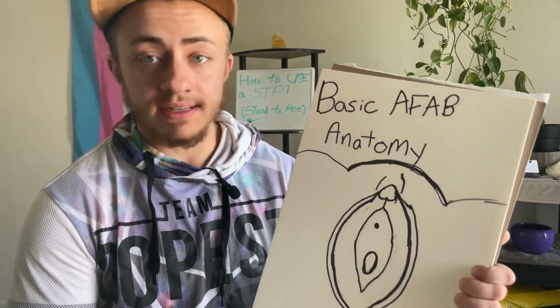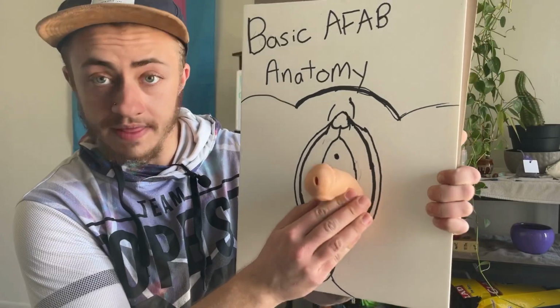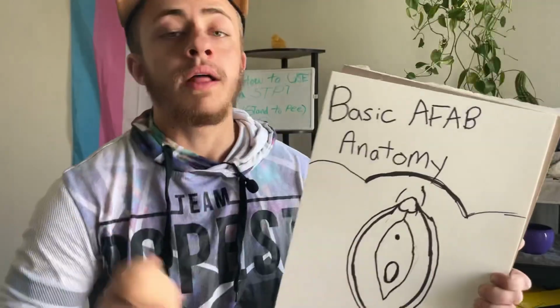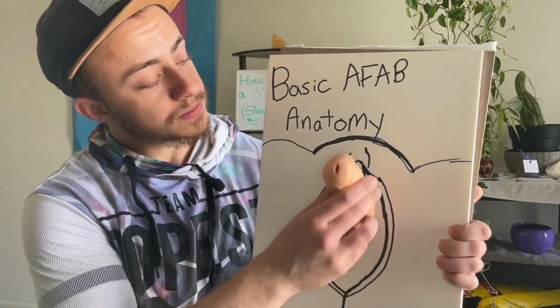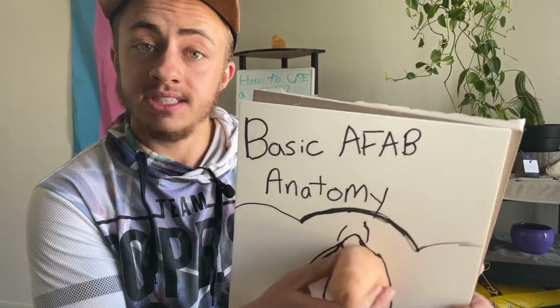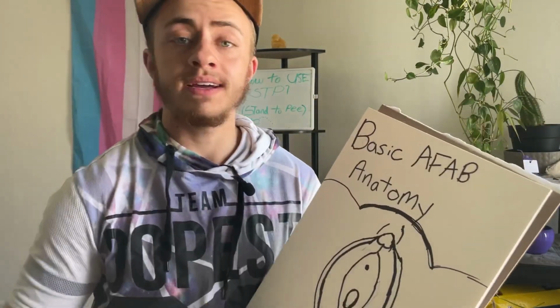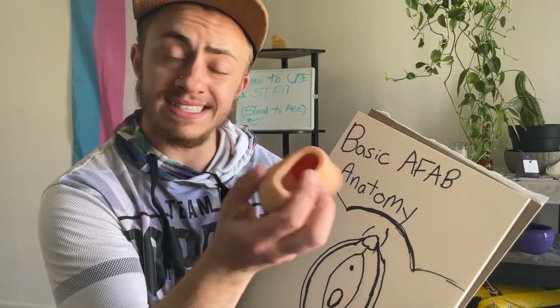For many people, it's how they're positioning their STP. They're putting it closer to their front hole, which would cause overflow on the front. The other thing that I've noticed is people are covering and using it where their T-dick is just on the inside, so it's about right here. So part of that, it actually makes more backflow happen because there's not as much space inside the cup.